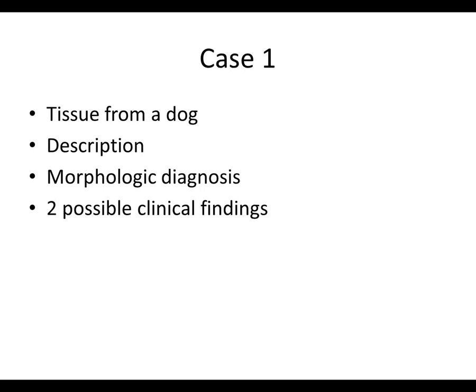For these, anything that would be seen in the nephrotic syndrome would be an acceptable answer: proteinuria, ascites, hypoalbuminemia. The key factor is not discussing the presence of azotemia, because these dogs have very minimal tubulointerstitial disease, and that would be something you would expect to examine in the tubulointerstitial compartment. We obviously just showed you photographs of the glomeruli, but the glomerulus is still patent and the capillary loops are still open. So azotemia is usually not seen, especially in cases where it's just a glomerular lesion and no tubulointerstitial disease.